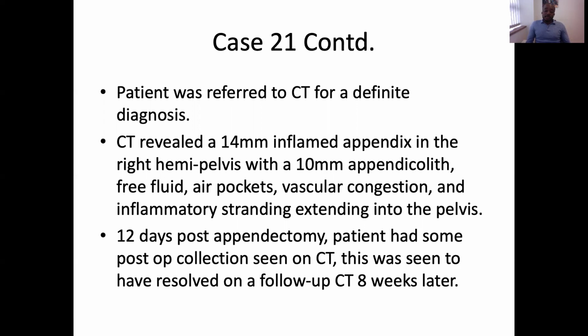However, the CT scan was done and then the patient had an appendectomy almost immediately. And 12 days after the appendectomy, the patient had some post-op collection, so they had to be sent for another CT scan. And then 8 weeks later, they had another CT scan, which revealed that the post-op collection and complication had all resolved.